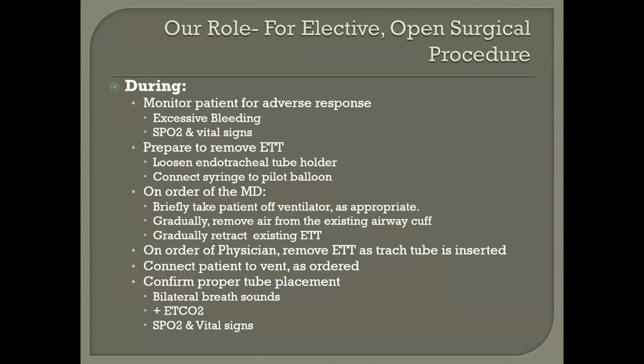Yes, we have an N95 on, we have eye protection, et cetera. The fewer secretions that you're aerosolizing in general is a good thing. In the advent of COVID, it's even more important. Gradually remove the air from the existing airway cuff on the direction of the physician, and gradually retract the existing ET tube on the direction of the physician, removing it on their direction as well. Connect the patient to the vent as ordered.